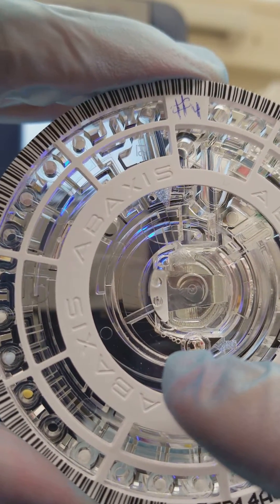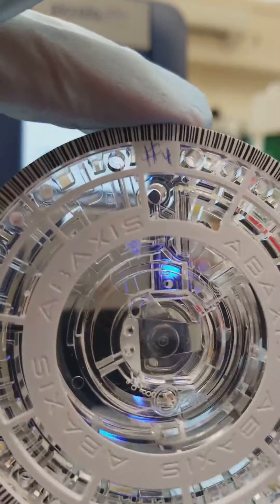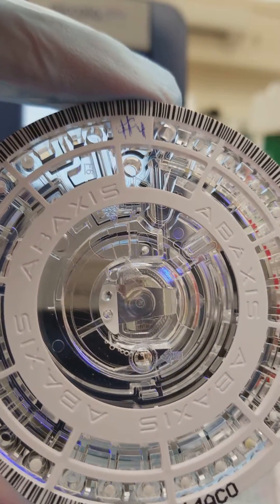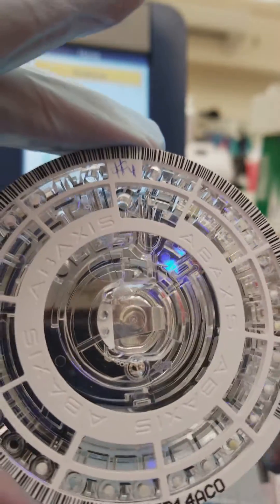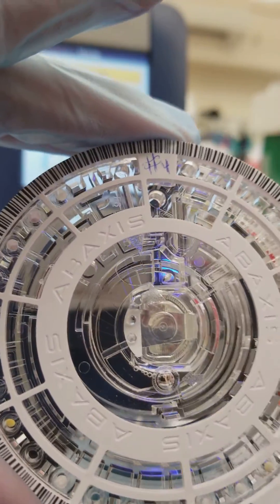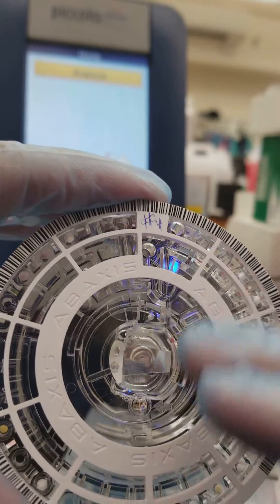I tried to do a video a few minutes ago and I got so caught up in filming that I messed up. I cut in between the video and I allowed bubbles to get into my pipette tip and accidentally put some in there. So we're not going to run this one, but I wanted to show you — so don't touch the top here.